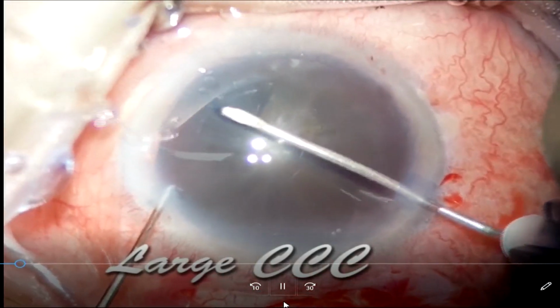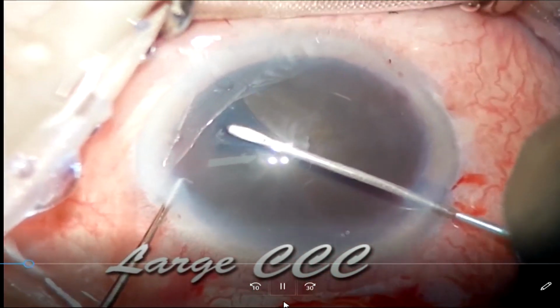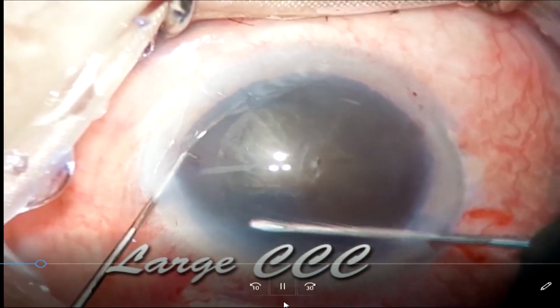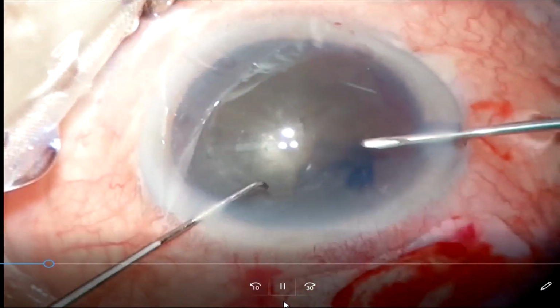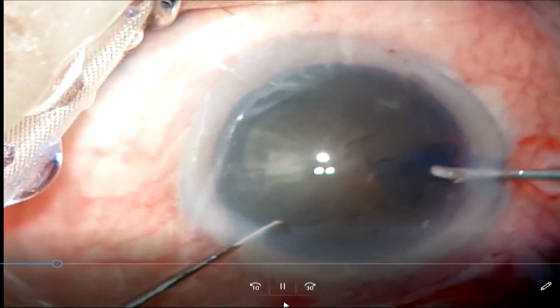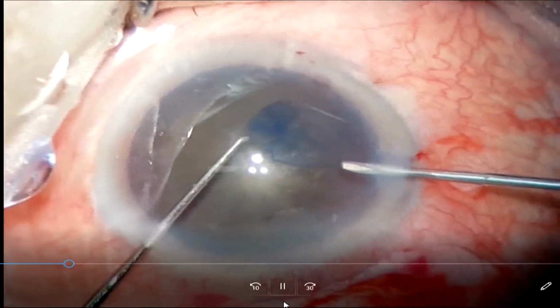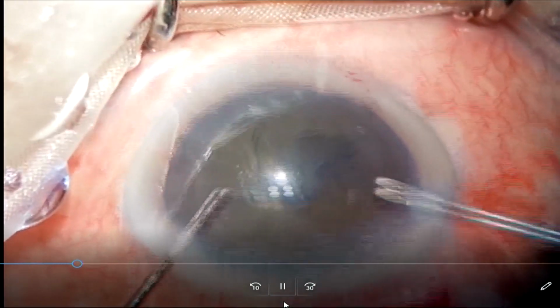And this is the rhexis. Now remember, the size of the rhexis corresponds to the size of your nucleus. If you have a nucleus which is very large, don't try to make a small rhexis. By and large, your rhexis size has to be 6 millimeter or larger in SICS, but if it is a very large nucleus and you make a small rhexis, you will end up doing an intracapsular cataract extraction. If by chance you have ended up creating a small rhexis, you need to enlarge it further before you go in for prolapsing the nucleus into the chamber by giving 2 tangential cuts.